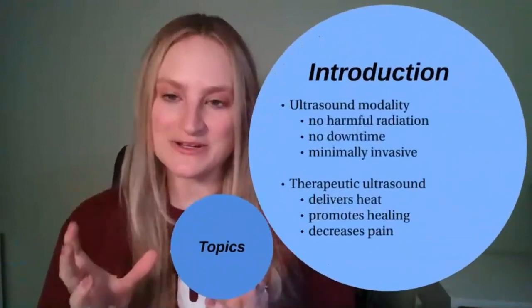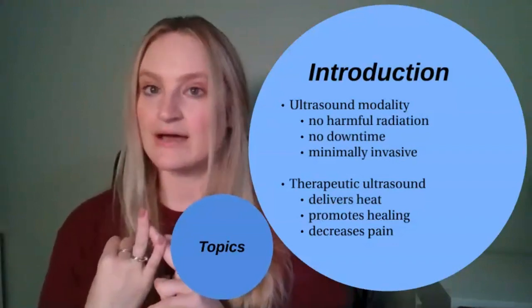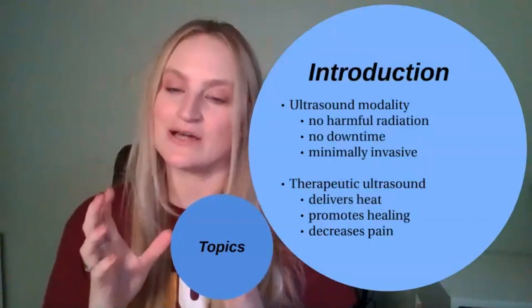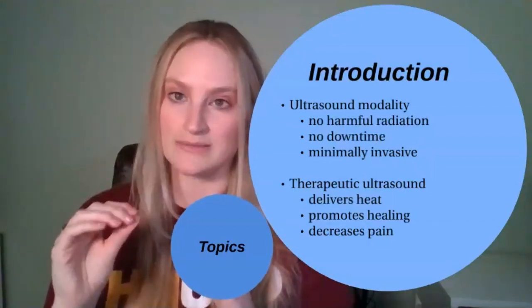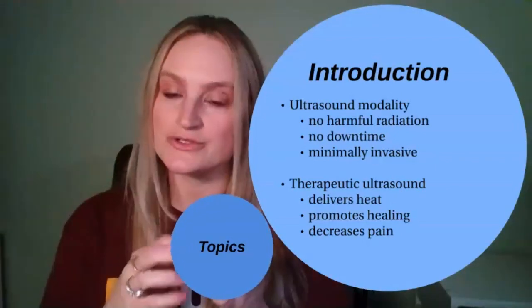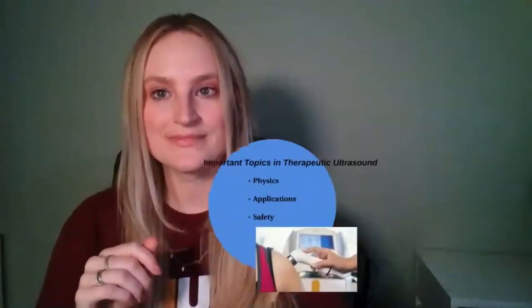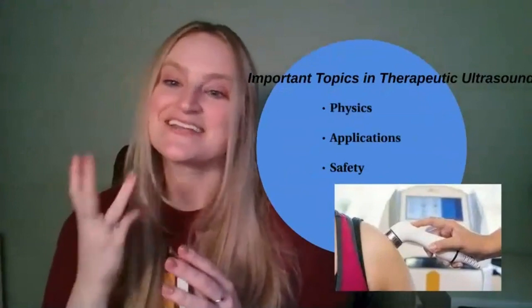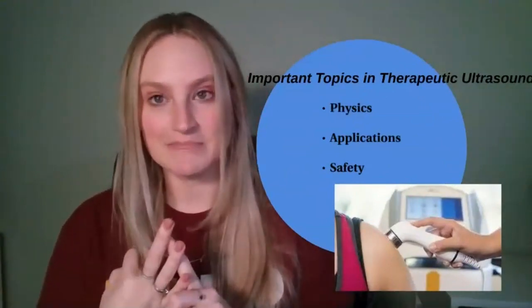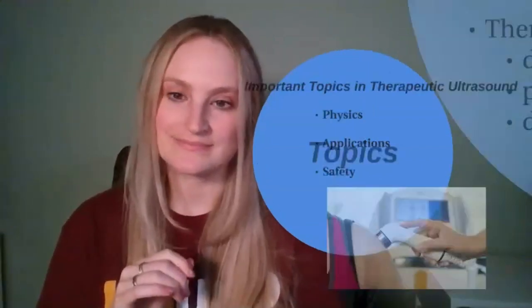Ultrasound is an excellent medical imaging technique that does not contain any harmful radiation, does not require any downtime, and is minimally invasive. Therapeutic ultrasound is a subtype within the ultrasonic modality that utilizes heat delivery to soft tissues to promote healing and decrease pain. Today we will be discussing three main topics: physics, applications, and safety. Then we will go over a few quick questions and conclude.